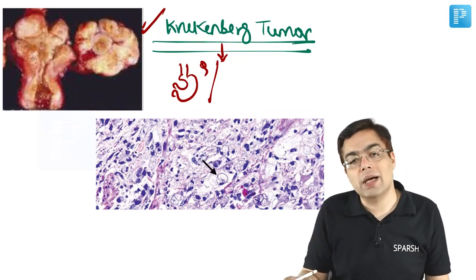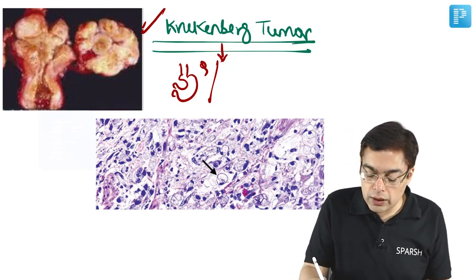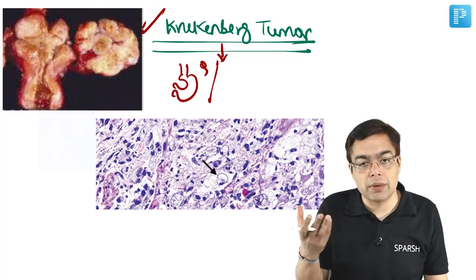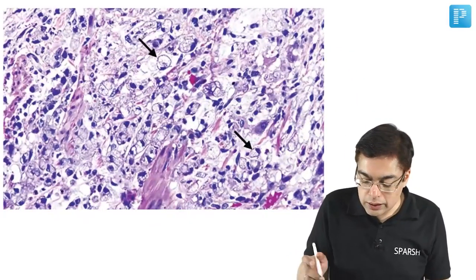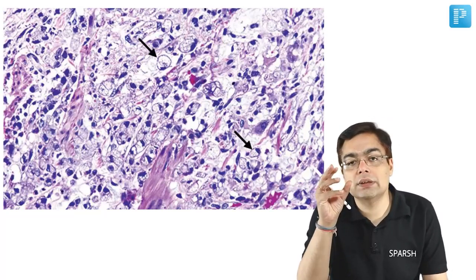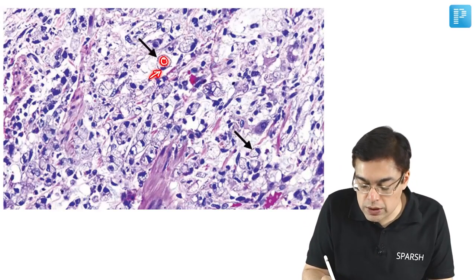Of course, the patients could have colonic cancer, or they could have mucinous breast cancer as well, in order for us to identify the presence of a mucinous cancer. Say for example, I'm talking about a gastric adenocarcinoma, or for that matter a colonic adenocarcinoma, I would be looking at the microscopic picture, and the microscopic picture would give me a very important hint. You would have tumor cells with mucinous vacuolations, and because of those mucin-containing cells, the nucleus is pushed towards the periphery.